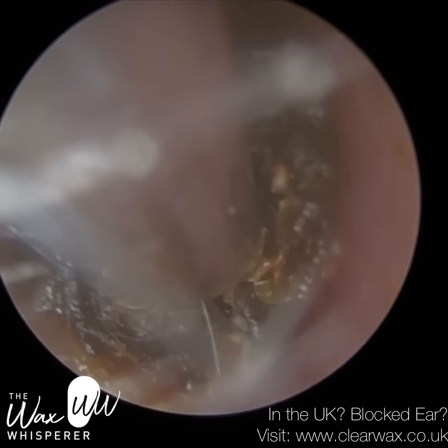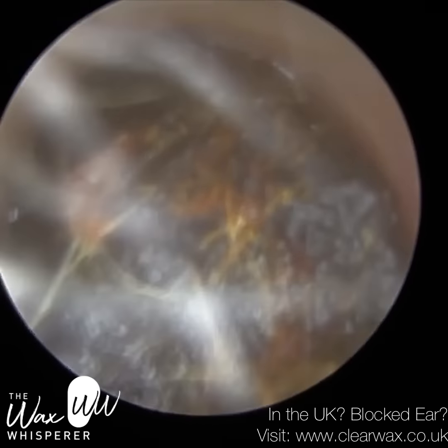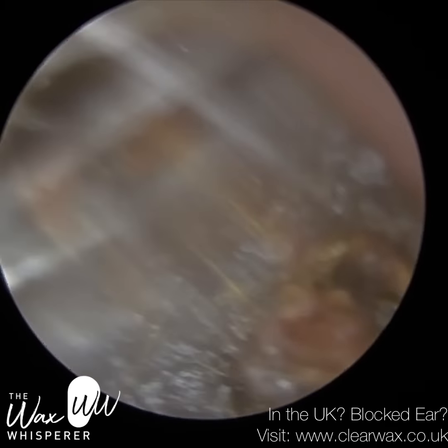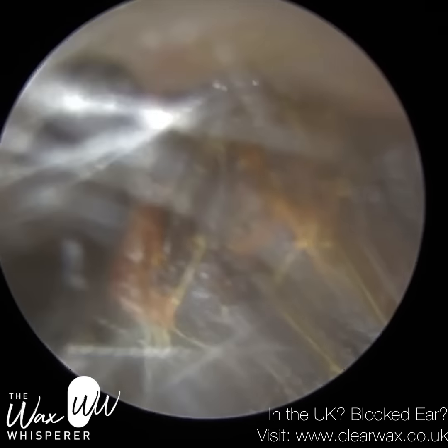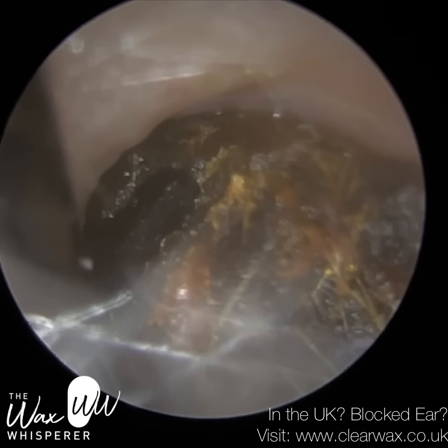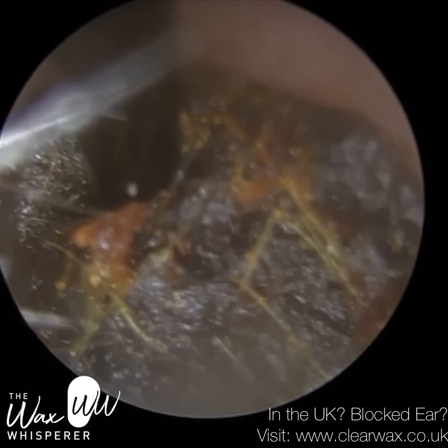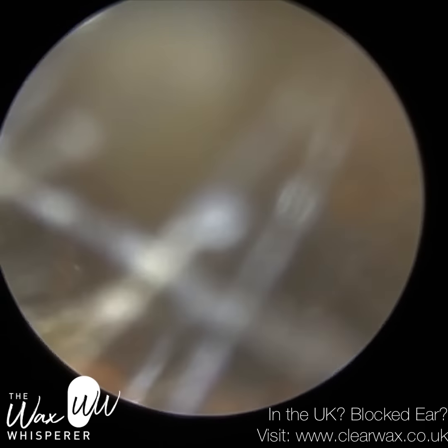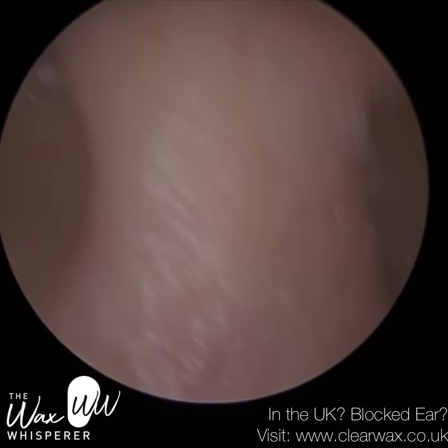So the right side, although it's still difficult, wasn't as complex as their left ear. I'm just using the hook, trying to get over and behind. So this one is probably a grade 1 Keratosis Obturans, as the other one is grade 2, or this is possibly pre-Keratosis Obturans. It's not technically Keratosis Obturans at the moment, but without any further treatment, it would become so.